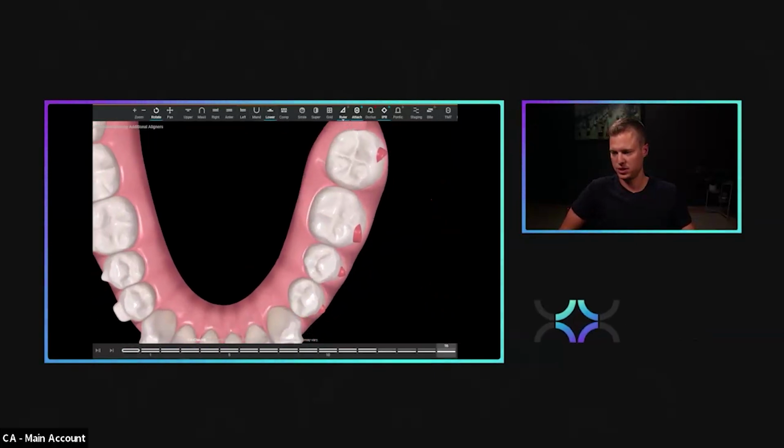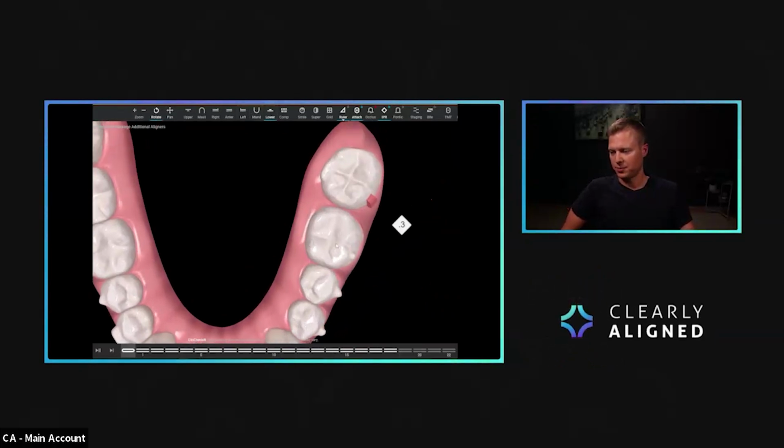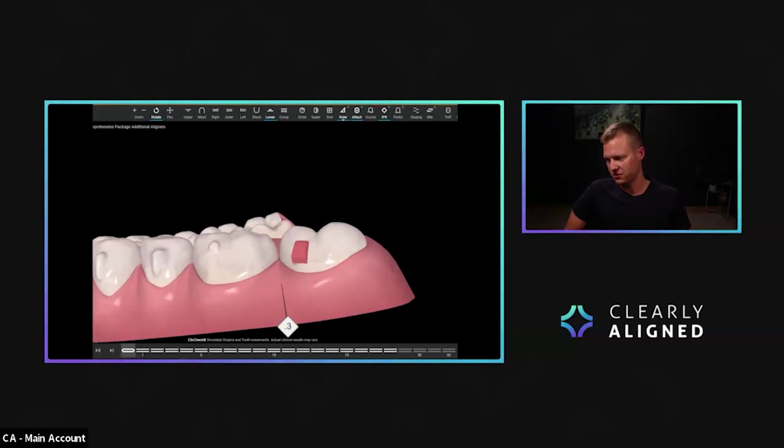Just to derotate. Unfortunately, the optimized attachment did not fully rotate the tooth, and there's a teeny bit of space there, no big deal. So we put on a conventional attachment, and we finish that rotation with a conventional attachment. We also put in then, because there was a bit of space, some fake IPR. So that fake IPR is just for us to force the contacts tighter together.